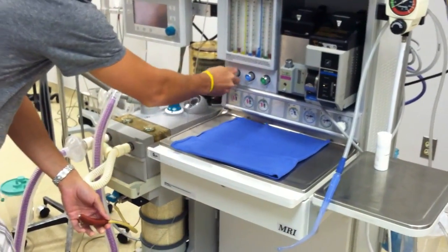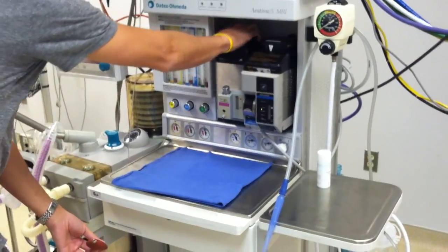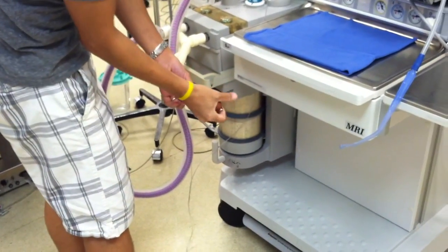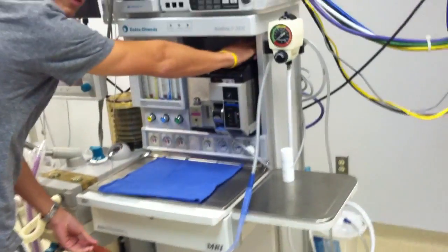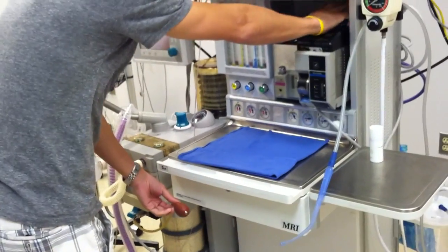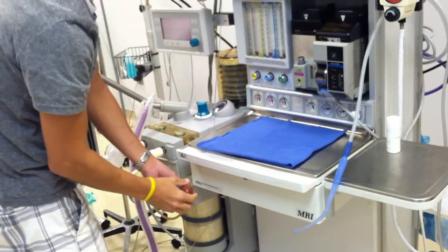You want to make sure all your flow meters are turned off. Now I'm going to check my vaporizers to make sure they don't have a leak: open one up, squeeze the bulb, and make sure it holds. While I'm here, I'm going to check my interlock system and make sure that I can't open up the other one at the same time. I would do the same thing for DES, but because it has no agent, it's not going to let me check.